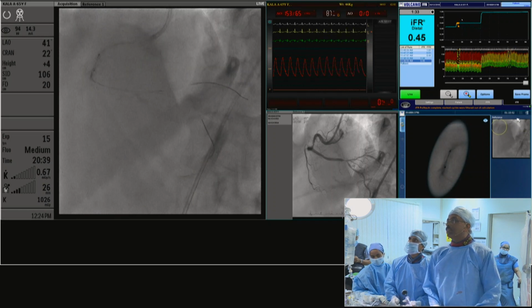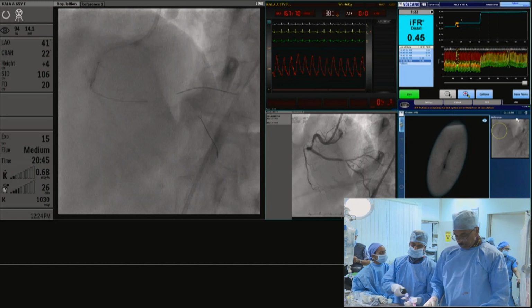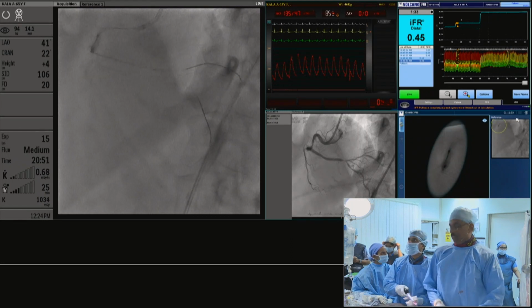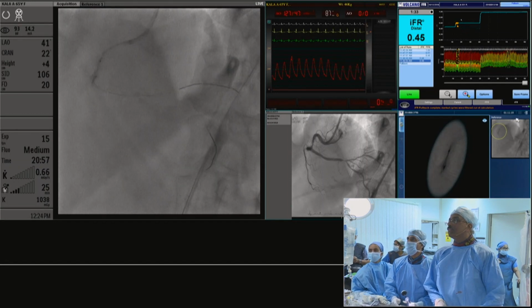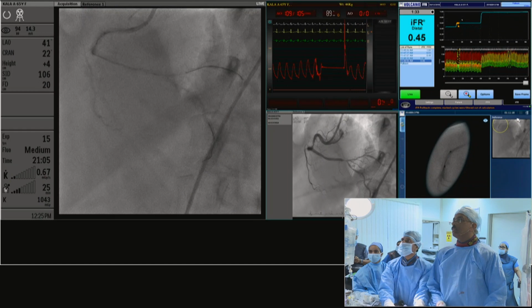You can also argue that the buddy wire could act as an angiosculpt. I exactly had the same question, because I thought the company does not recommend another wire with Angiosculpt. I have asked them this question. But do you all use this on a regular basis? There's absolutely no contraindication to using it, but not with a Flextome. There's no contraindication to using this.